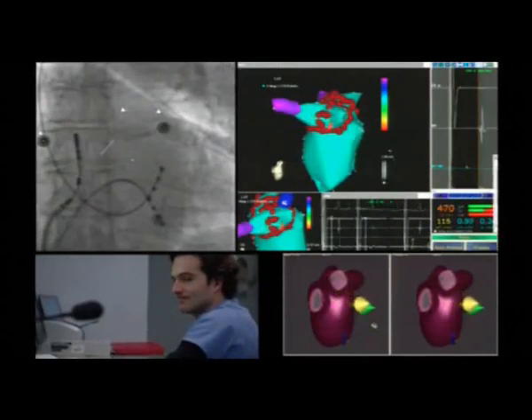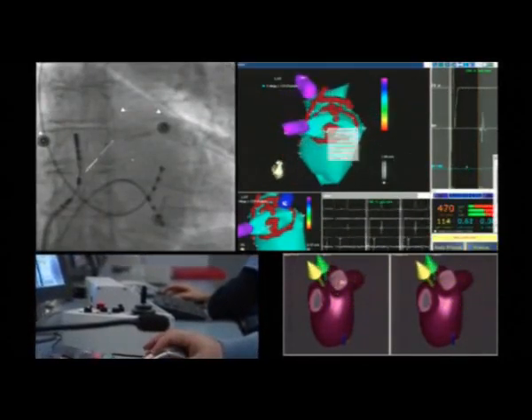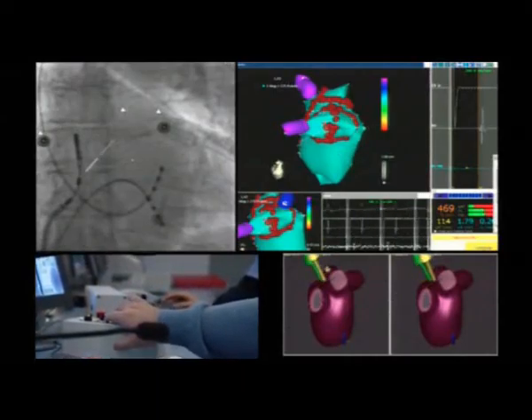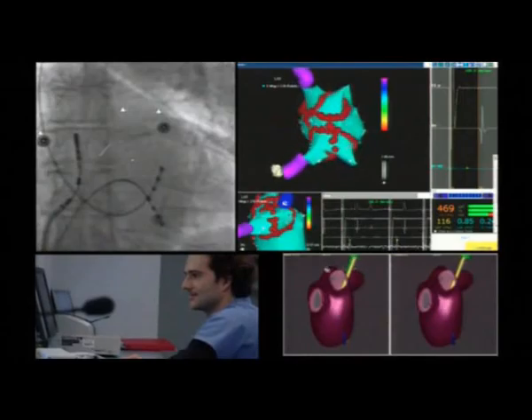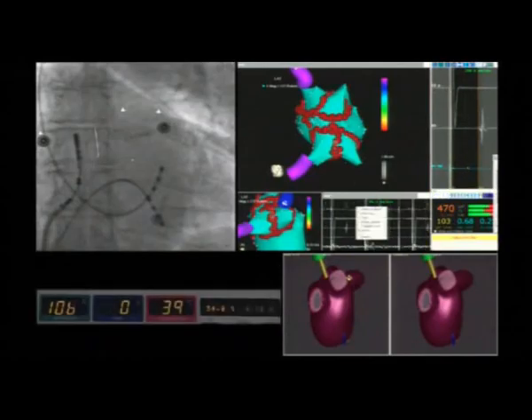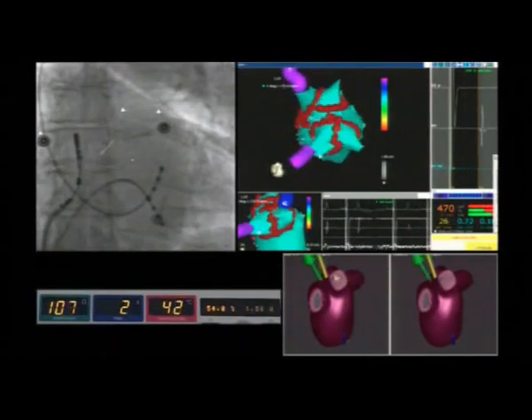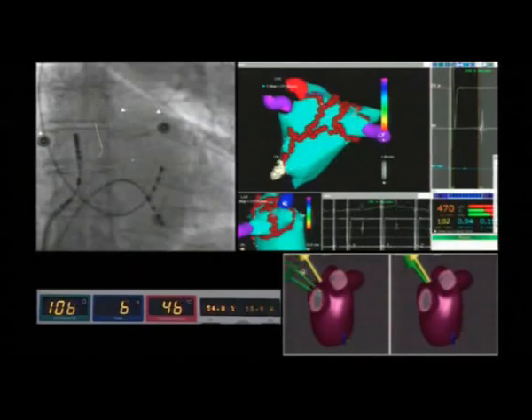The view of the atrium is constantly rotated in order to give a better view to the operator. The lesion separating the right superior pulmonary vein and right inferior pulmonary vein is now complete.